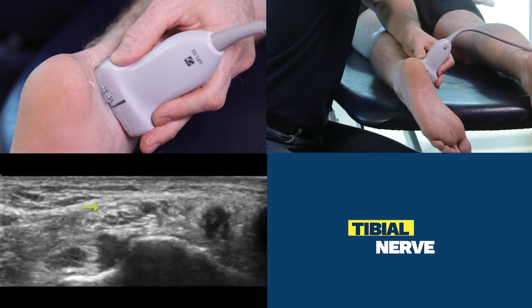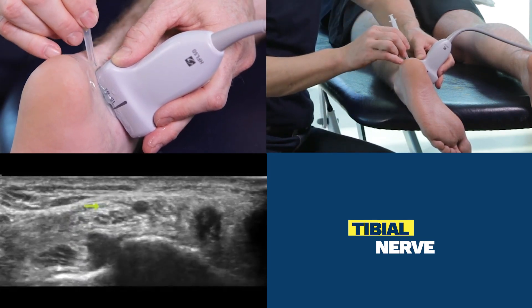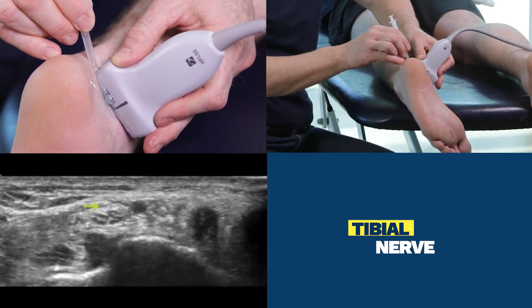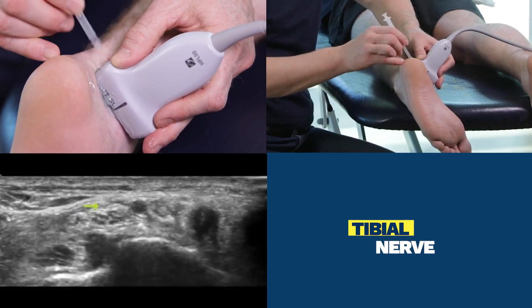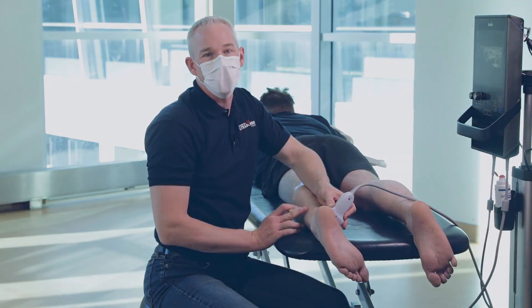Alternately, you can place your needle tip just superficial to the tibial nerve with the same needle entry angle — same needle entry point, slightly different angle. And that's how we scan and inject the tibial nerve at the medial ankle.